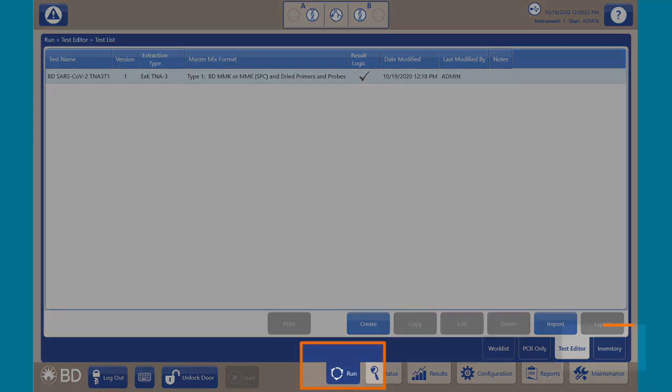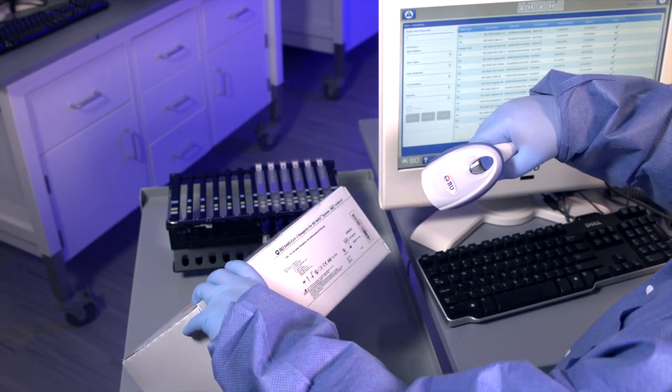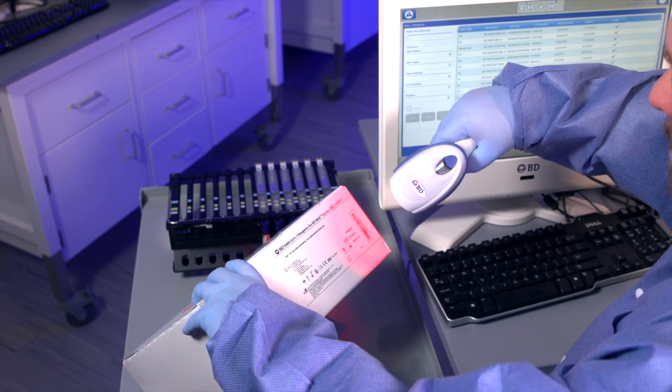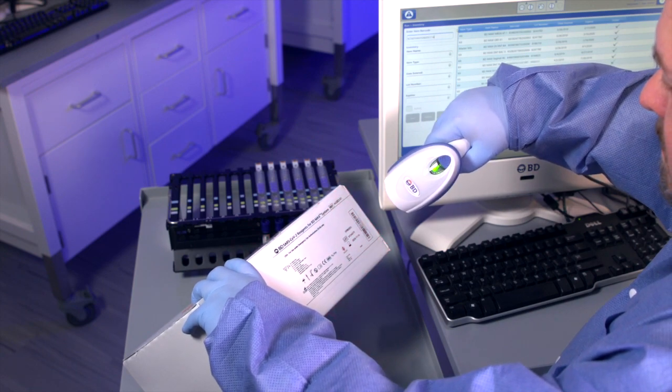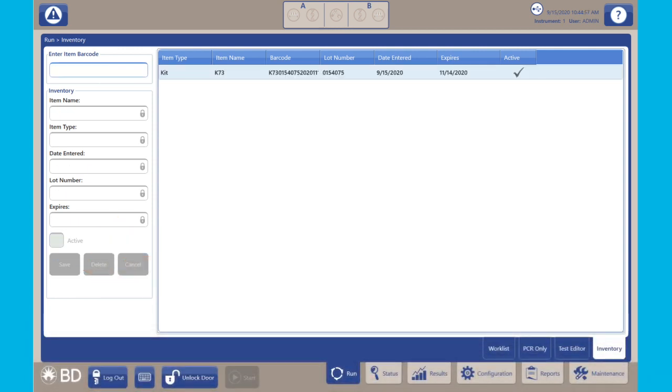Click on the Run tab, then Inventory. Enter the kit lot number for the BDSARS CoV-2 reagents for BDMAX System Kit by either scanning the barcode with the scanner, or by manual entry, and then Save. Repeat scanning or entering the barcode each time a new kit lot is used.